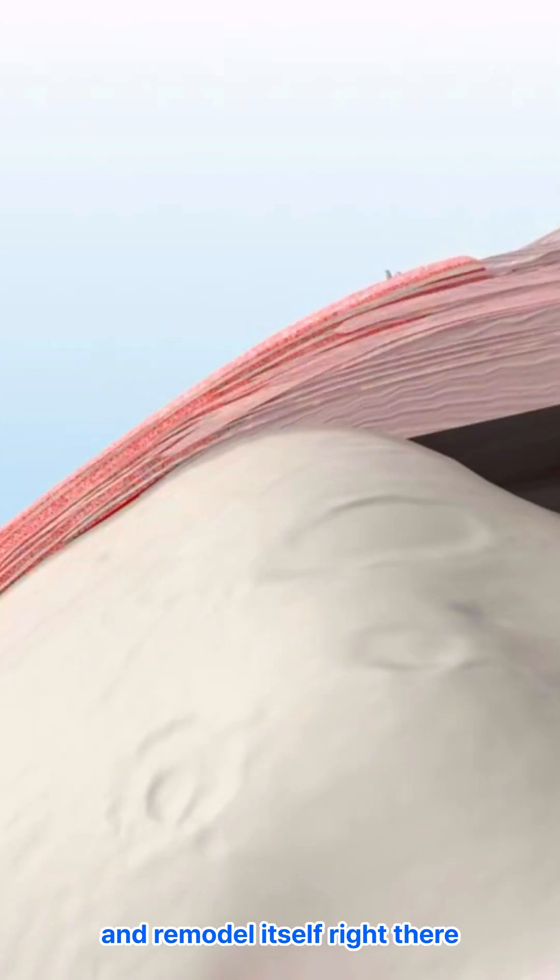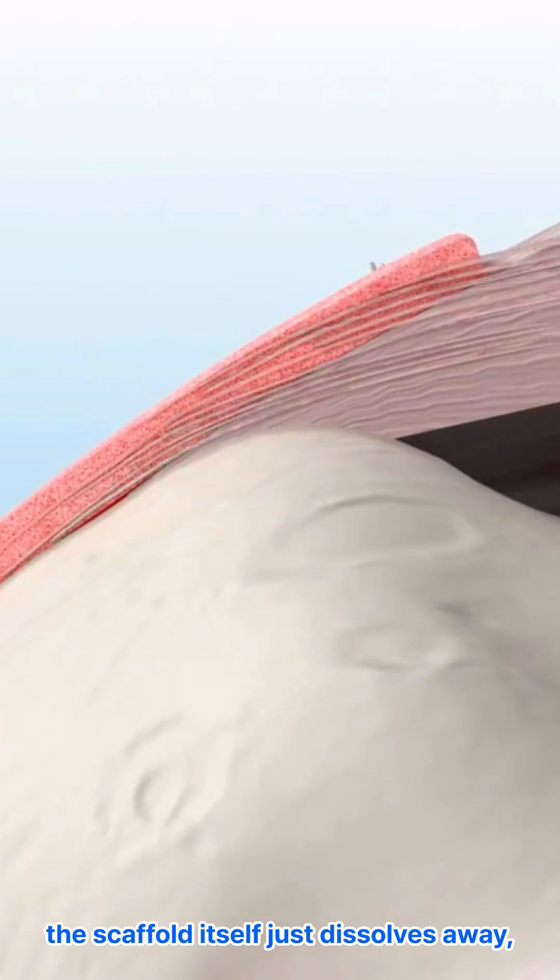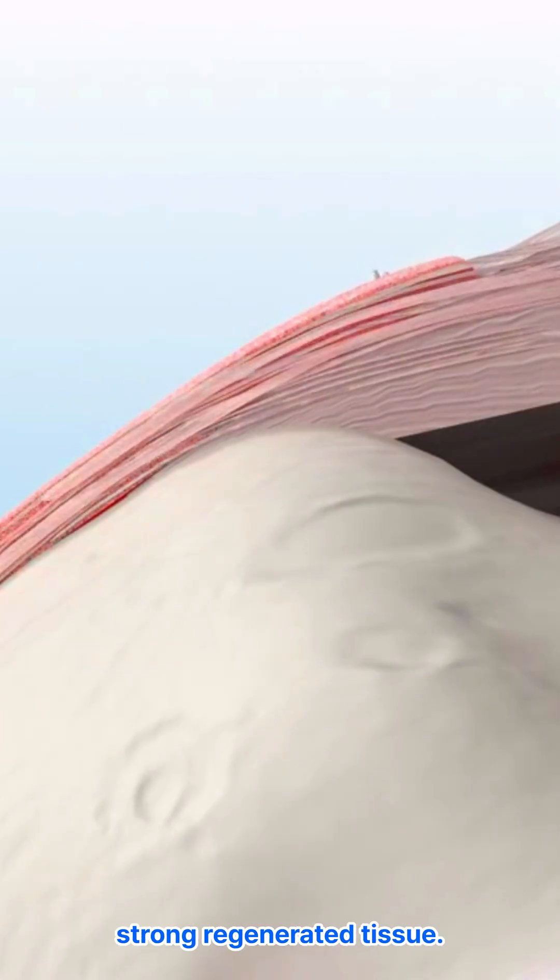It helps tissue mature and remodel itself right there. You get faster tissue growth into the scaffold, and eventually the scaffold itself just dissolves away, leaving behind your own strong regenerated tissue.